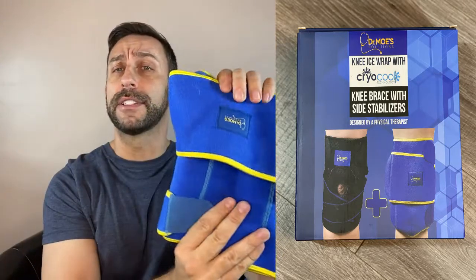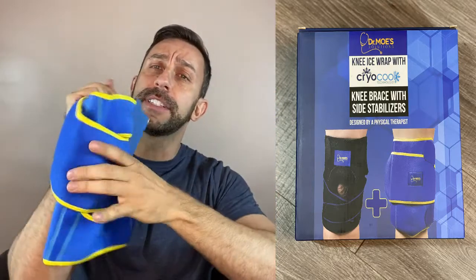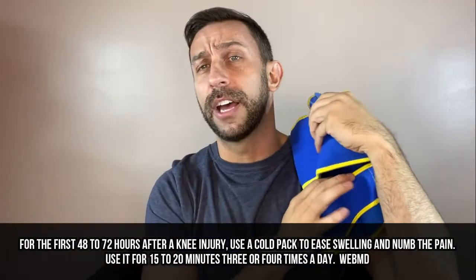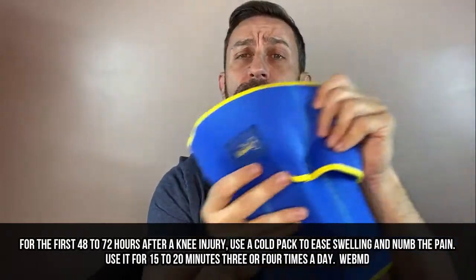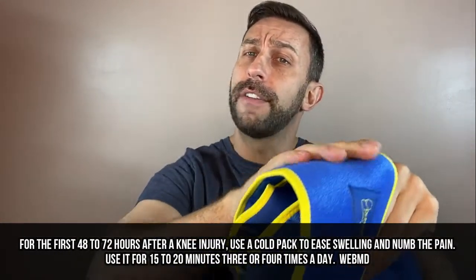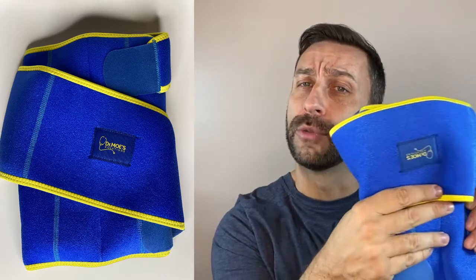First off, let's look at the ice knee brace. Now this thing's pretty awesome, and just as an FYI, this can be used on your knee. It can also be used to ice your arm or other areas. Just three hours in your freezer and you've got more than 30 minutes of cooling technology. You can see it's soft to the touch — this thing's not going to leave you with a freezer burn feeling, which a lot of ice packs will. This is a much softer, better way to treat your skin.